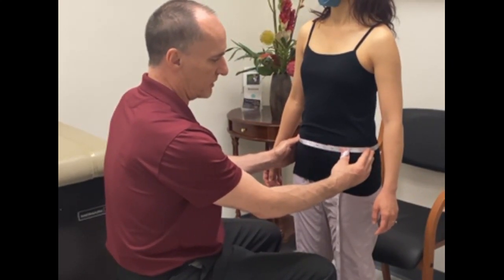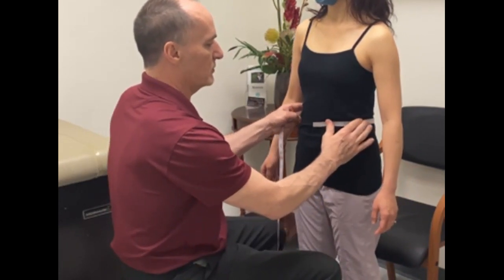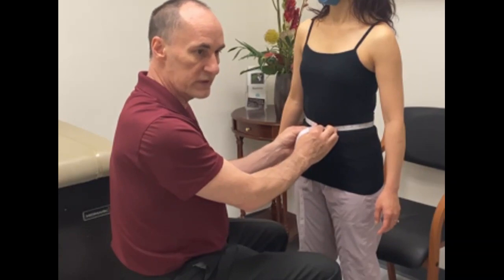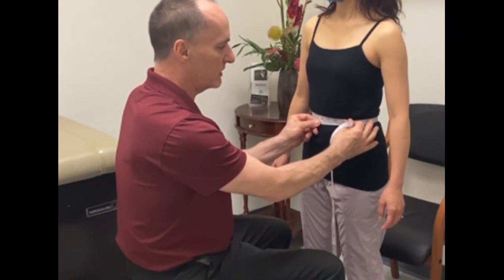Take that circumference measurement and record it on your measurement sheet. Then take the waist measurement — this should be the narrowest point of the body and your smallest measurement. This one should be pulled a little bit snugger so there's a little bit of tension on the tape.